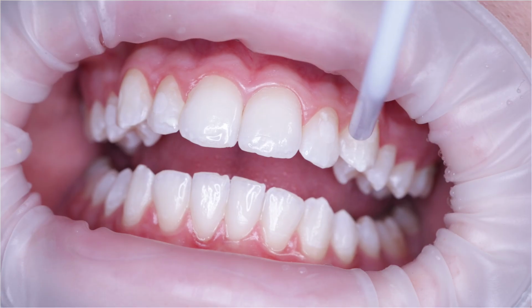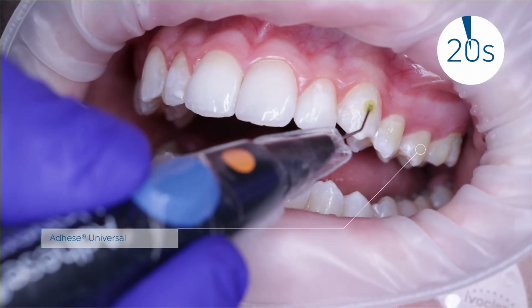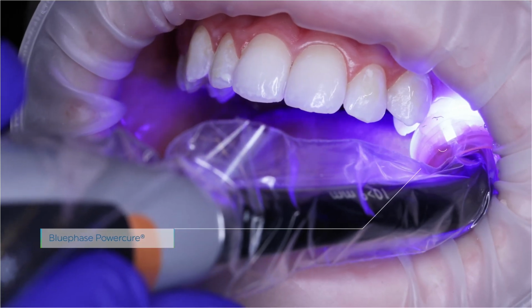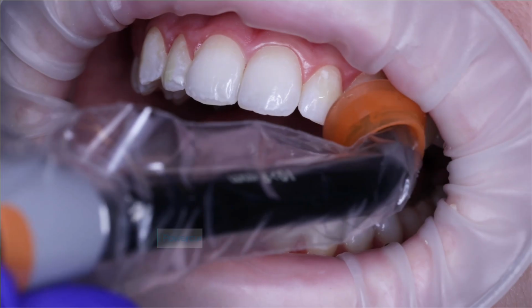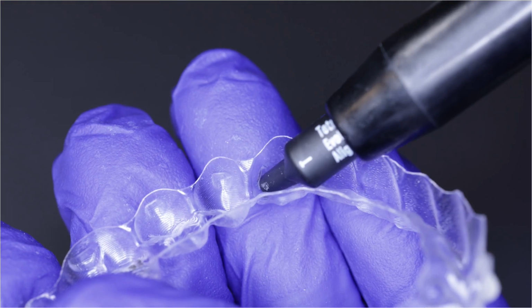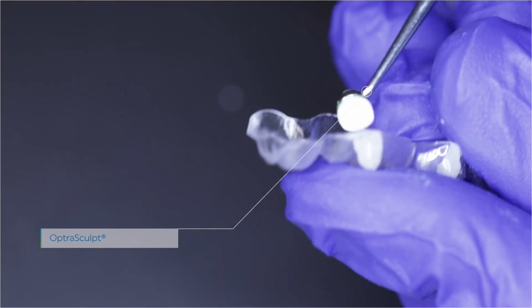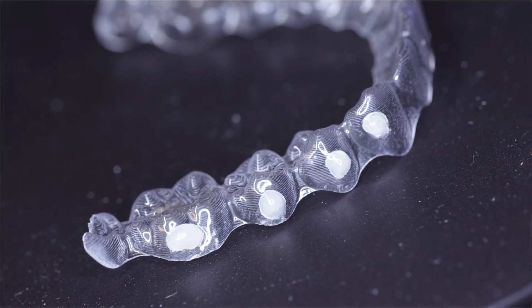Because remember, if we set a timer, we want to make sure that we know each area is nice. We rinsed it. It's frosty. It has a sealant-like frosty appearance. So this way, when we dry the teeth, we're going to scrub in that adhesive. We're going to make sure everything's nice and dry, and we're going to cure with our Power Cure Blue Phase light. So we want to make sure everything is done correctly. We're going to place our composite right into the attachment template, making sure we pack that composite in with our OptraSculpt. And now we're going to seat that attachment template onto the patient.